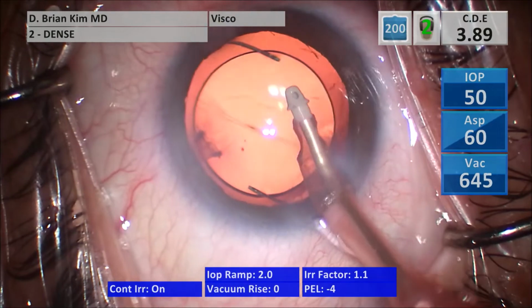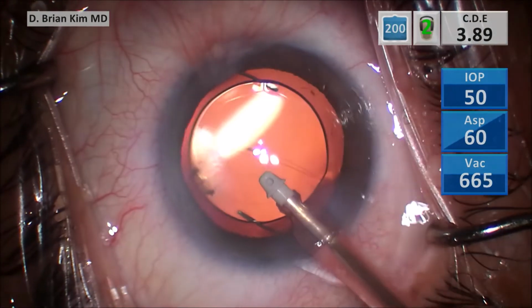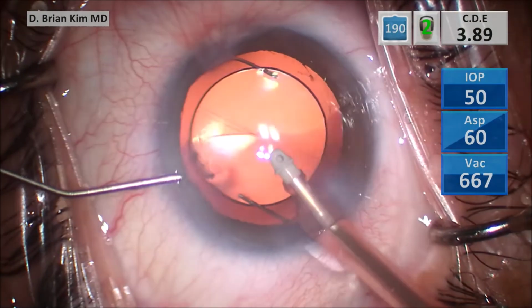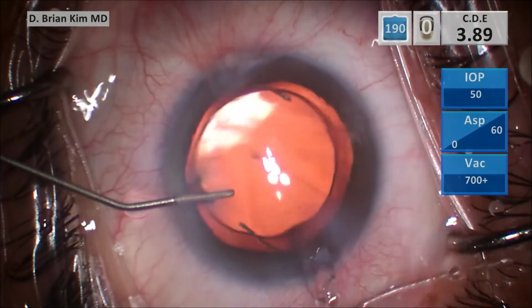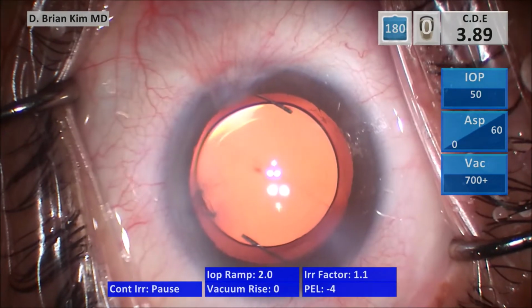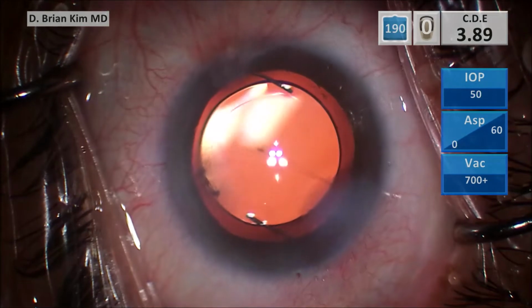So again, this is a 3+, rather sticky lens, a dense lens. I perform double chop, cross chop mechanical fracturing techniques. Again, during the chopping maneuvers, you don't see any tilting of the lens. You're not seeing any translational movement of the lens where I'm moving it from side to side. There is essentially zero traction on the zonules with this technique. Again, you want to think of it as a poor man's MyLoop in the sense that the forces are directed towards the center to cut the lens.